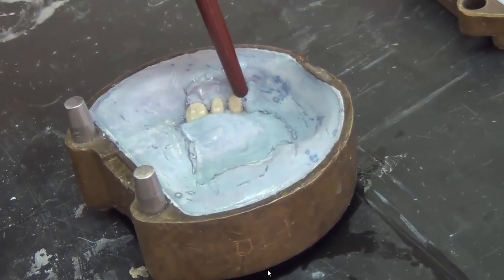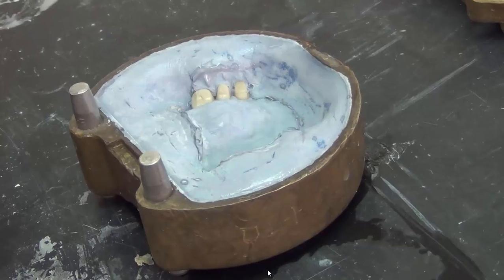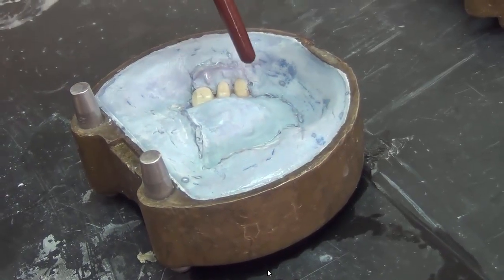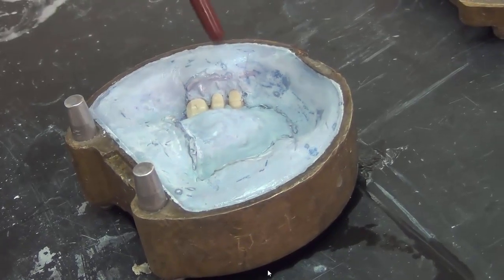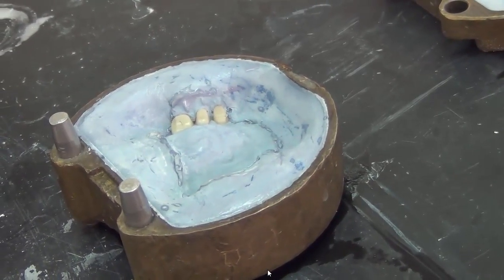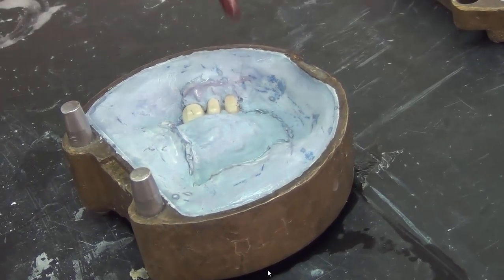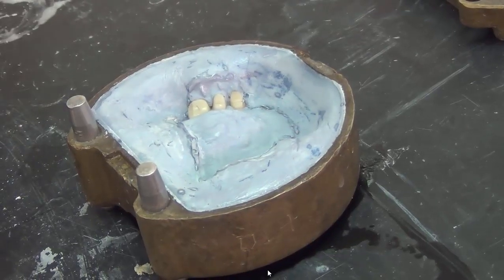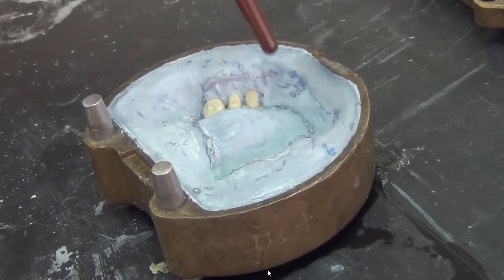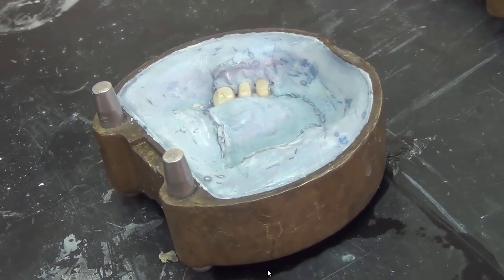The function of this monomer is that it will partially dissolve the fitting surface of the teeth. This dissolution makes it soft and it will swell. So the new monomer, the new acryl, will begin its polymerization from within inside the teeth. The way that acrylic sets is by polymerization chains. Once we paint this with monomer, the unset monomer will soak the surface and penetrate in between the previously set acrylic teeth, because these have been set at the manufacturer site. So the monomer will soak inside and penetrate, and then once the polymerization reaction begins, it will begin from inside the teeth. So the polymerization will connect the acrylic dough with the teeth better, and this is an actual chemical interpenetrating network. This is the name of it.